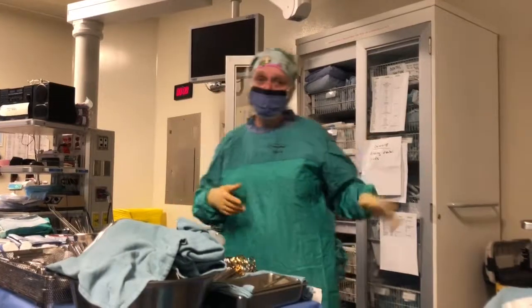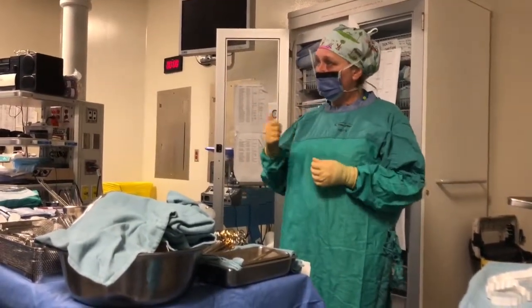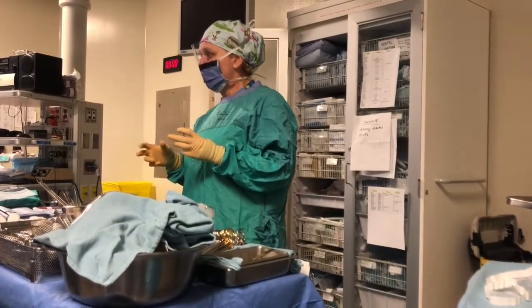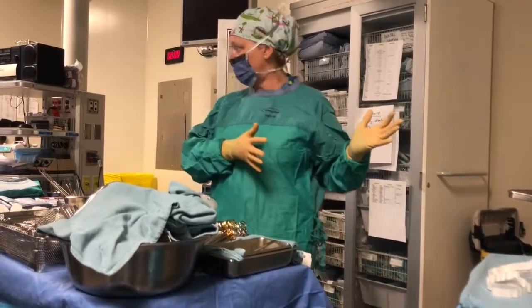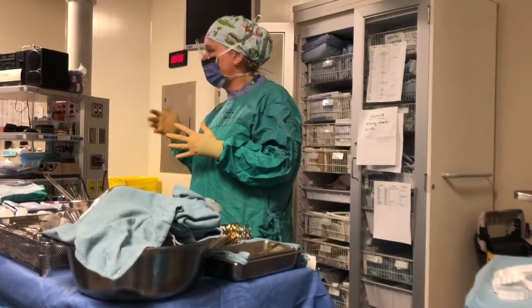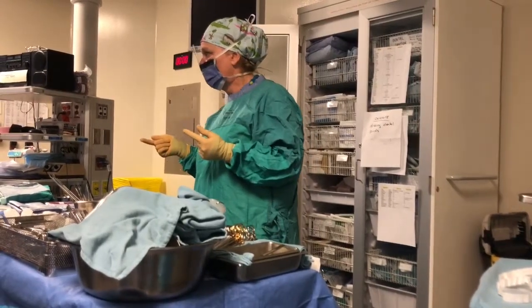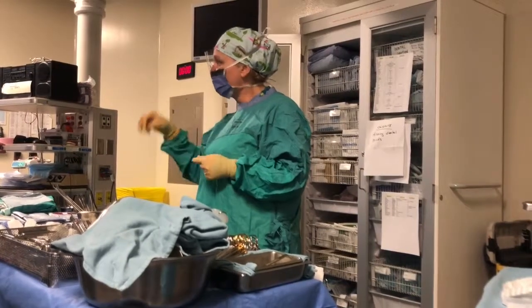I have my circulator, she's constantly counting off 5, even though we didn't count, because chances are we're gonna be in multiples of 5, right? So at the very end of the case, let's say she's counted off 39 sponges. I know there's either going to be 11, there might be 16, left. So I'm going to count and see how many there are, and let's say we come up with 13. Well, then I know that I'm missing 3, right? So I'm going to get him to take it out.